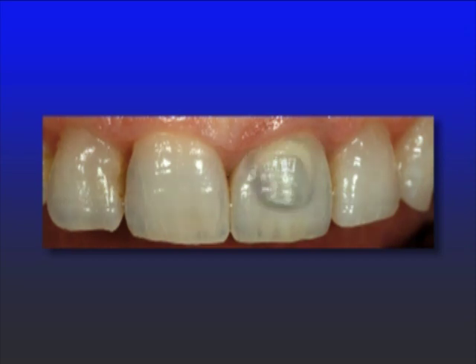In this particular patient, it was that left central incisor that had the endodontic therapy and the post-core done. And what I chose when I did this was actually a metal ceramic crown. Metal ceramics is able to completely mask that underlying post and allow the technician to have a very predictable view of what the final color will look like in the laboratory.